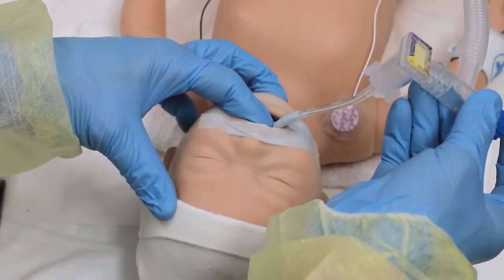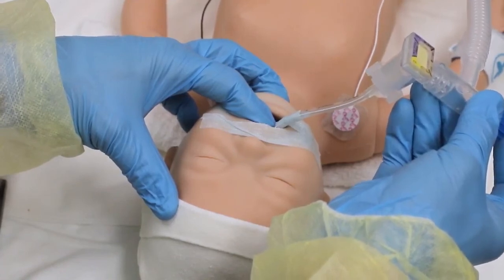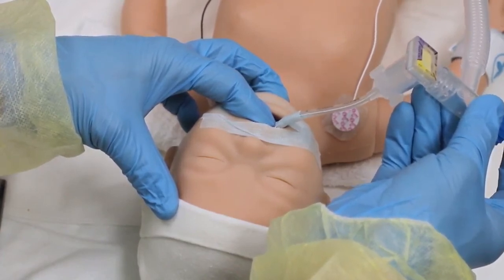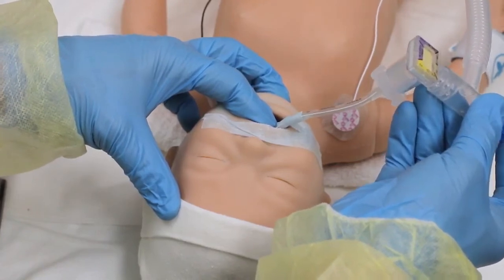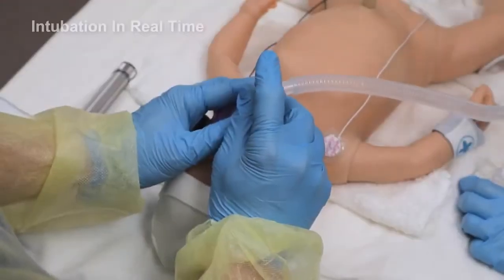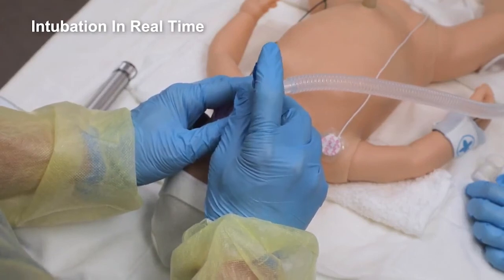To prevent accidental dislodgement of the tube, the person providing PPV should hold the PPV device and the tube. The ET tube is held against the hard palate with the index finger. The third finger rests against the chin, and your thumb may rest on the baby's head. Here is the intubation process shown in real time. Note the roles of the intubator and the assistant and how they work together as a team.